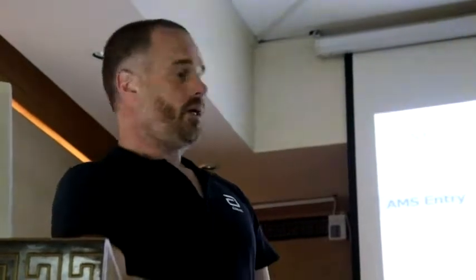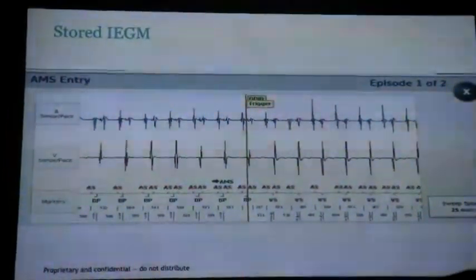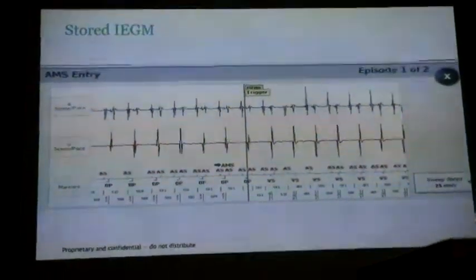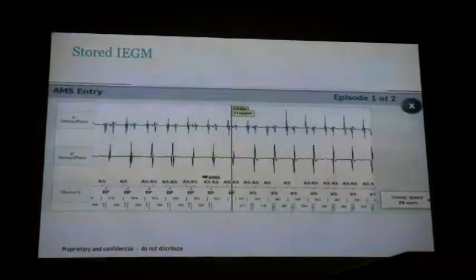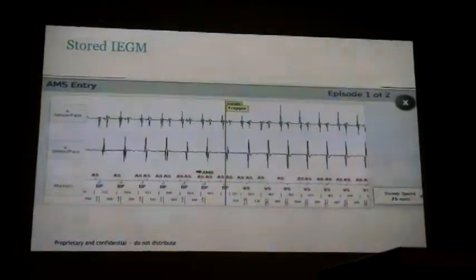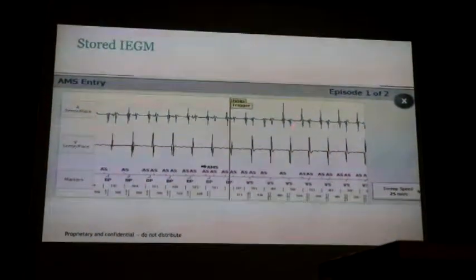So I would definitely be looking at the P wave amplitude at implant, but if there is a far field, you want to look at that in two, in sensed, so A sense, V sense, and A sense V pace, because it can change. And if you see a large far field R wave, that's why we have the cable with the four pins, two for the atrial, two for the ventricle, so that we can pace and see the atrial. So it's useful to be able to.